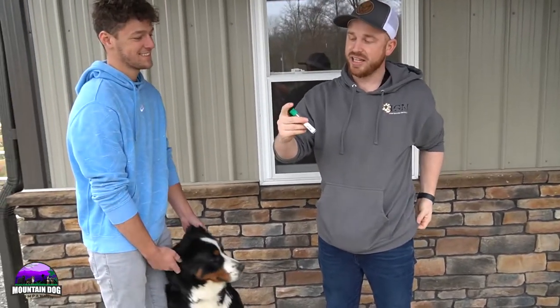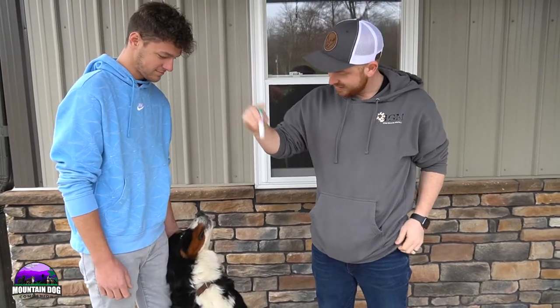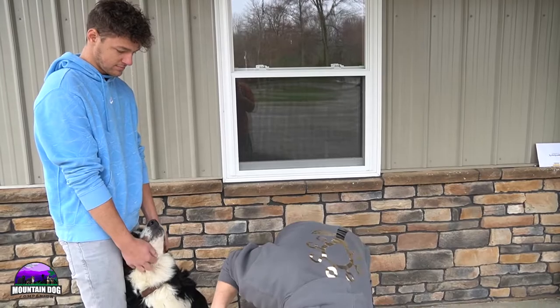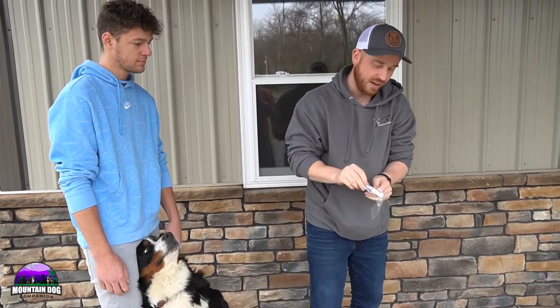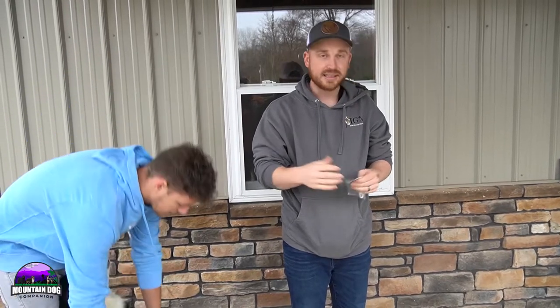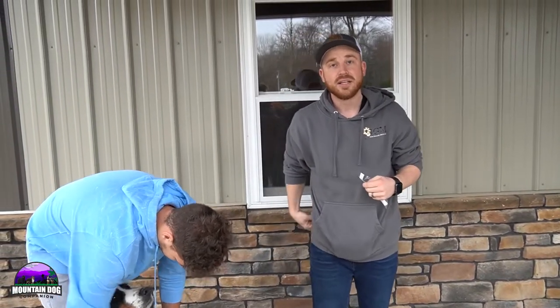And then we just give it a nice shake like this, get it all mixed in there. And now we're ready to ship it back out to the lab with Embark. And guys, that's how we do our genetic testing here with the Embark test. You guys can check that out on our website underneath the parent profile.